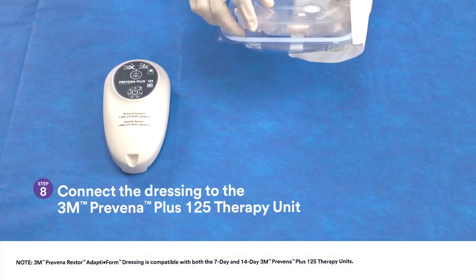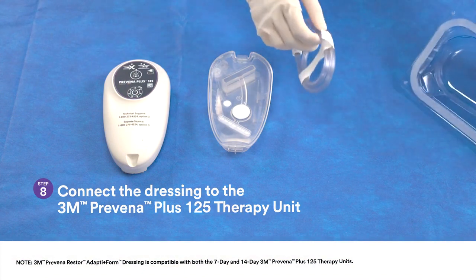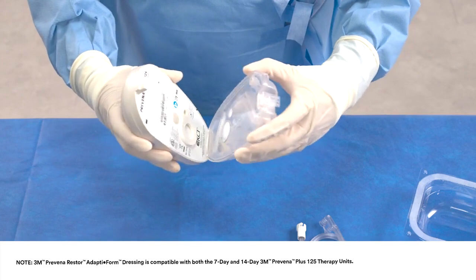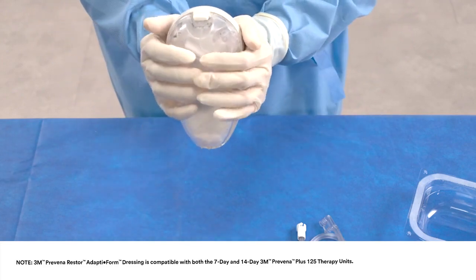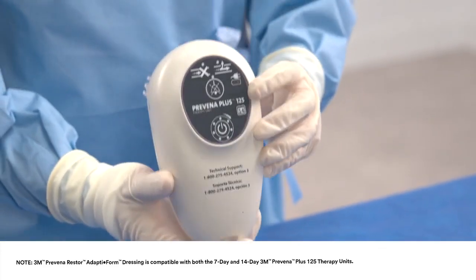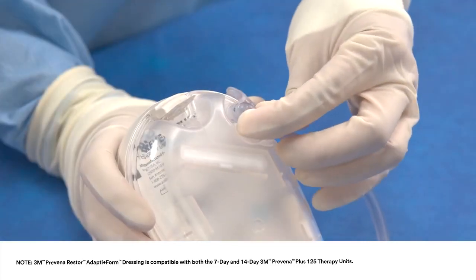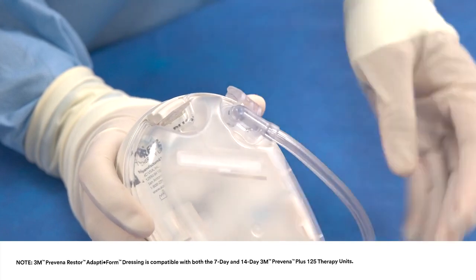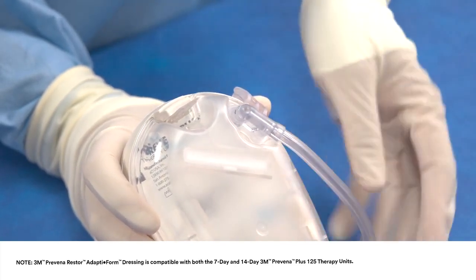Next, connect the dressing to the 3M Prevena Plus 125 therapy unit. Remove the canister from the sterile package and insert it into the Prevena Plus 125 therapy unit. Slide the bottom of the canister into the slot on the bottom of the therapy unit and close the canister against the therapy unit. Connect the 3M Prevena Plus connector to the canister by aligning and plugging connector at the end of tubing onto tubing ports on side of canister.